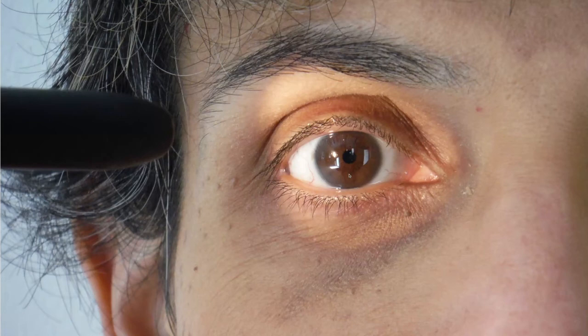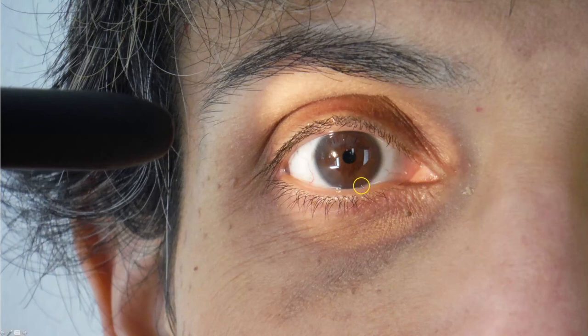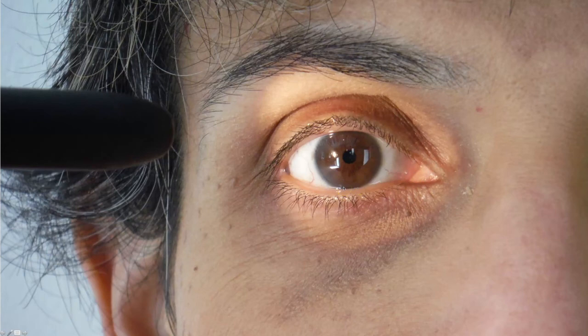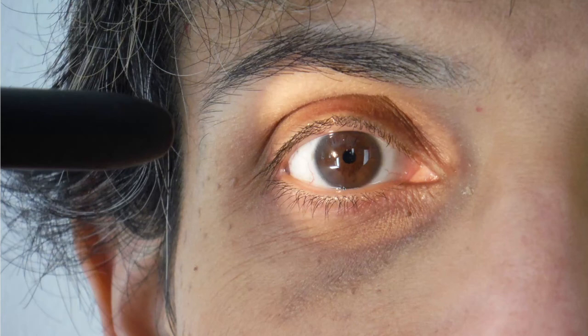If you have access to fluorescein dye, you should instill a tiny drop of dye into the inferior conjunctival fornix and get a blue light and reexamine the eye in dim ambient light. You might then pick up an epithelial defect, an ulcer of the cornea, or an abrasion.